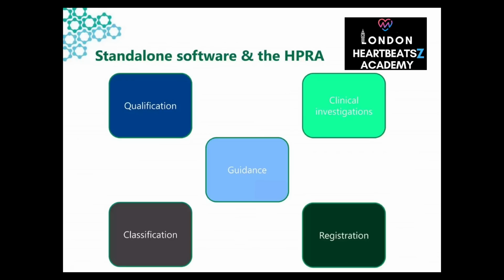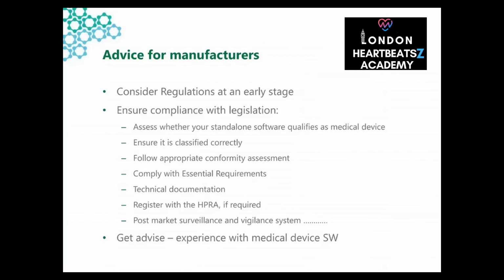Okay, this has been really insightful. Good, I'm glad. We've covered a lot of ground, from defining standalone software to the regulations, classifications, and post-market surveillance. Absolutely. It's a complex landscape. It is, and I think it's relevant to everyone these days. With all these health and wellness apps, it's important to understand the boundaries between just a general wellness app and something that's actually regulated.